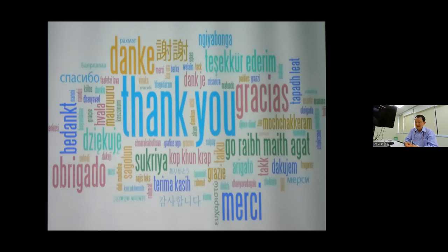But as I stressed earlier, good preparation, like good hydration and upright position, are the basic important things in correctly measuring our nuclear medicine imaging studies. So you mean that the Gates method obtained from the machine is enough, provided that you have good technique. Right. Okay, thank you very much.